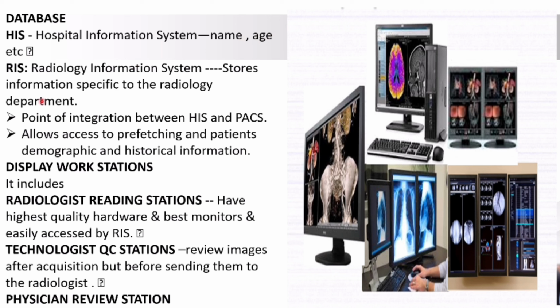It is particularly for the radiology department, which stores the information specific to the radiology department. We have a point of integration between HIS and PACS. It allows access to prefetching the patient's demographic and historical information. Now, display workstations. These are the workstations in which we are able to see images.